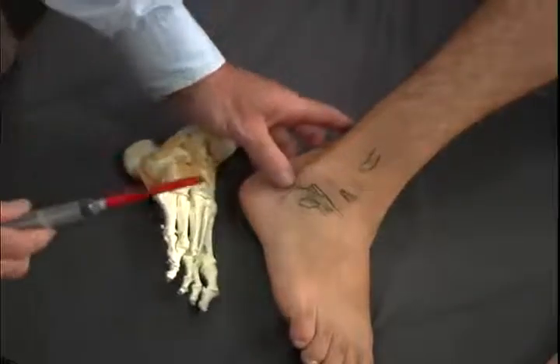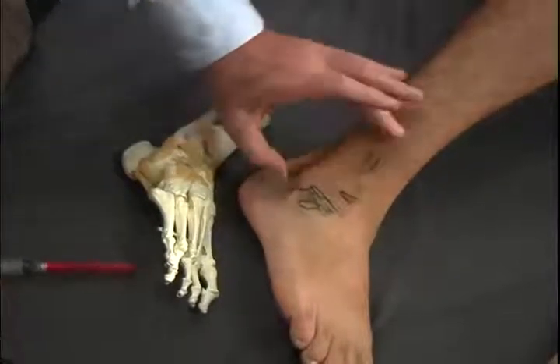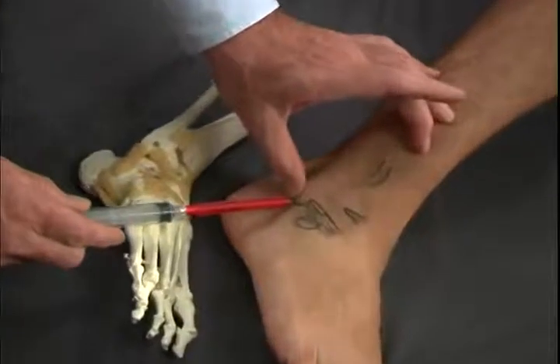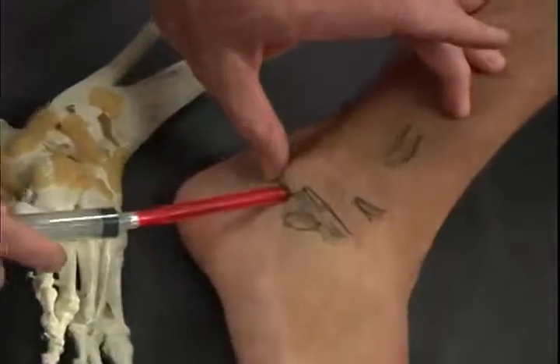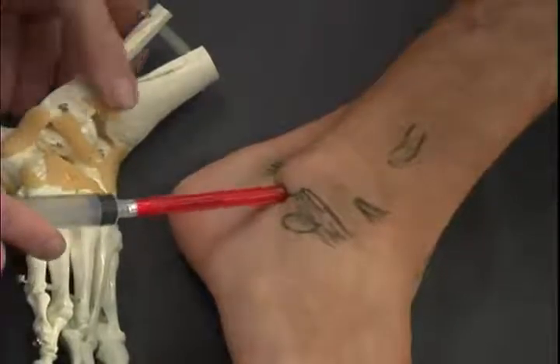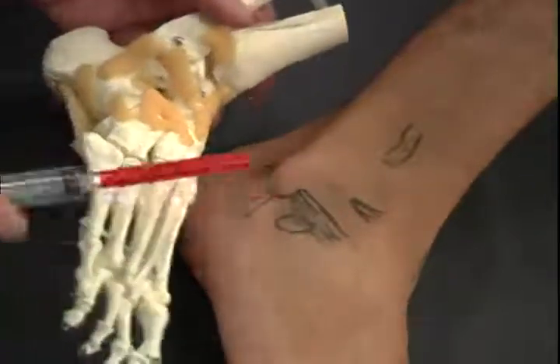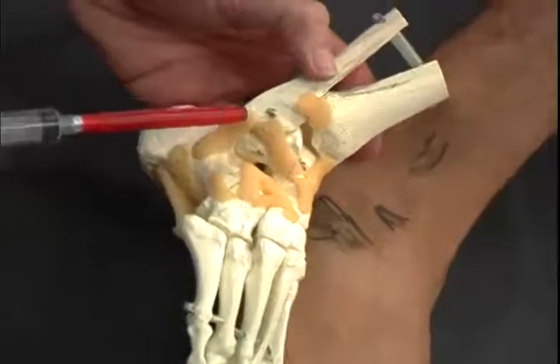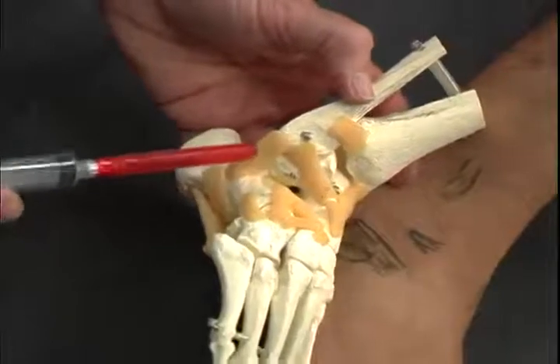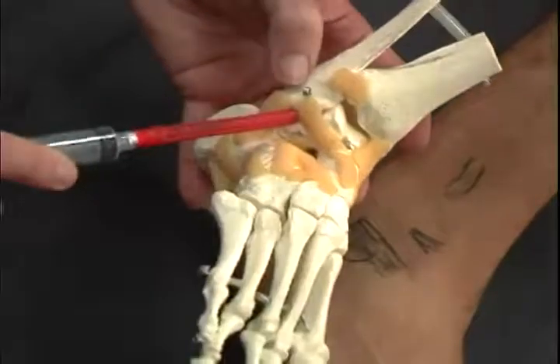One final injection in the ankle itself is the intra-articular injection, and this is fairly easy to accomplish if we come directly under the fibula. And so we feel the bottom of the fibula, and then our needle comes directly in under that, directly into the ankle joint for an intra-articular injection. We would be using 25% dextrose mixed with some lidocaine for this injection. We can see on our model that we're going right through the lateral part of the fibulocalcaneal ligament and coming in underneath that bone under the fibula that puts us right into the ankle joint.